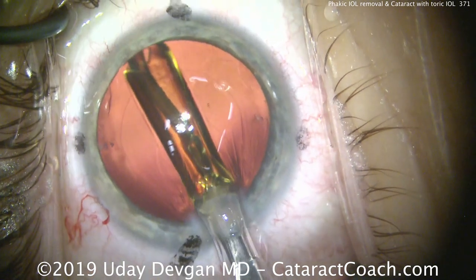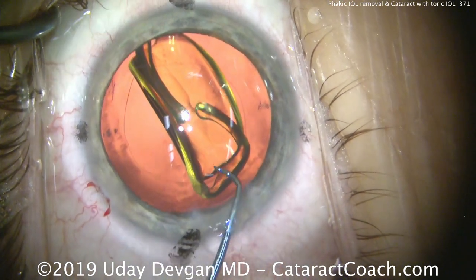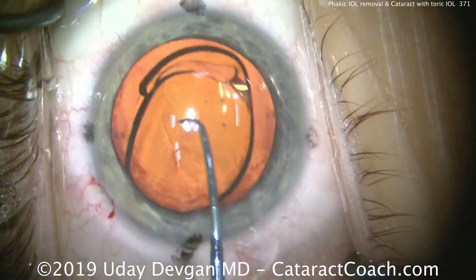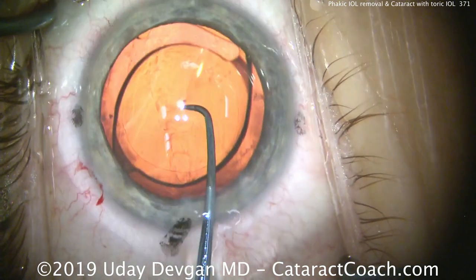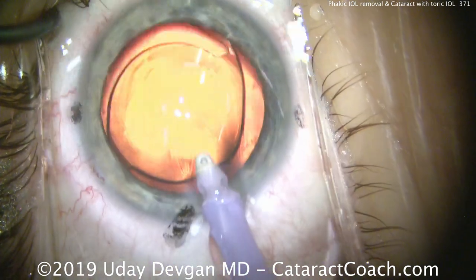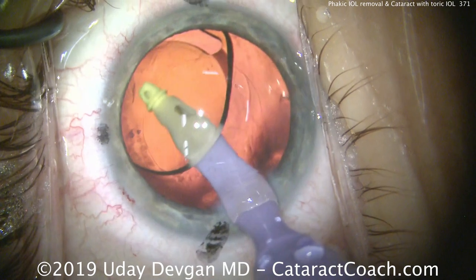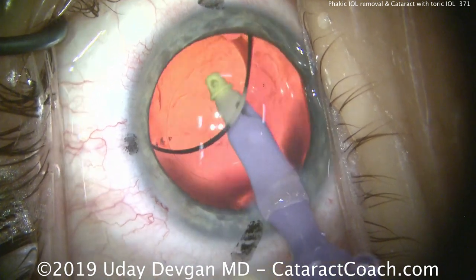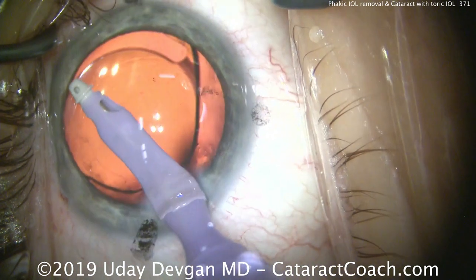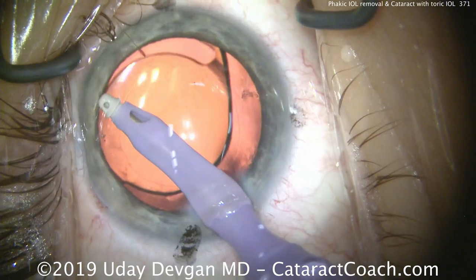As we've discussed previously, this lens rotates best clockwise, so we'll rotate it clockwise and dial it just a little bit short of where we want it. After we remove all the viscoelastic, we can reposition the lens at the perfect alignment. Very important: remove all the viscoelastic from behind the lens, because if you leave viscoelastic there, it can allow the lens to slip and change its toric astigmatism correction. To achieve lens stability, you must go behind the optic and remove that viscoelastic.